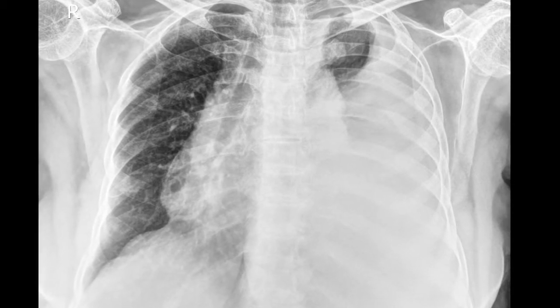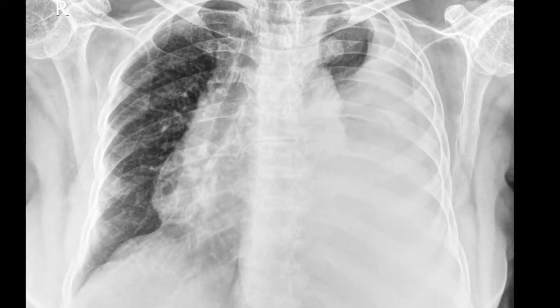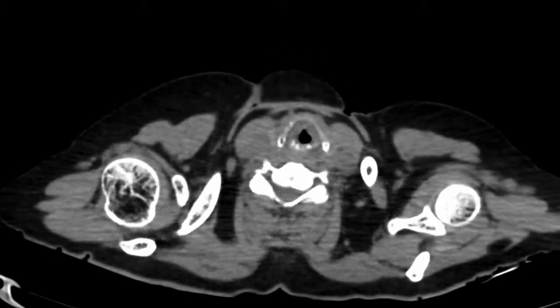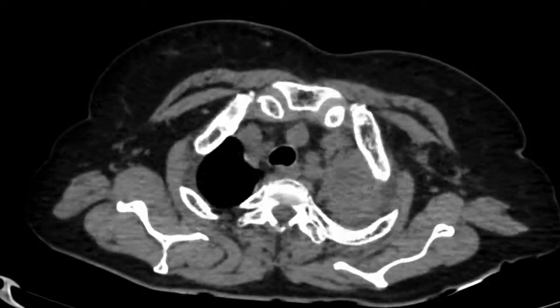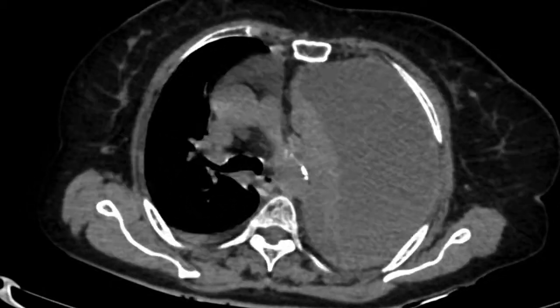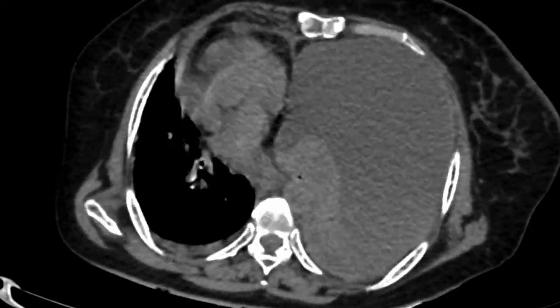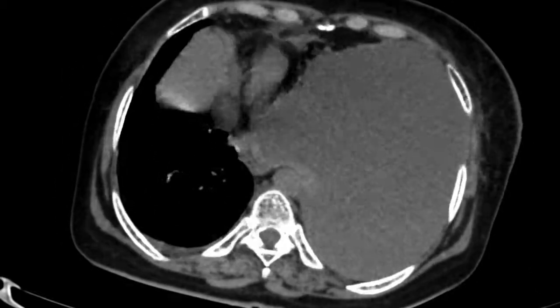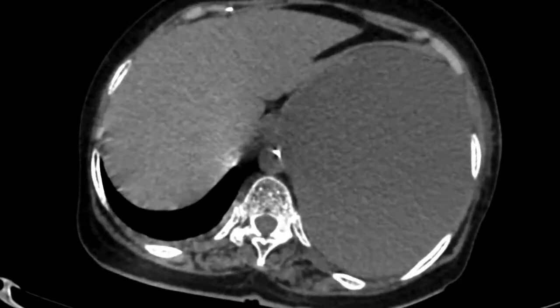We still have the cardiomediastinal shift to the opposite side, to the right side. We put the patient on a CT scan table to find out what the problem was. What we see here is a massive left-sided pleural effusion with the fluid completely occupying the left chest. There is underlying lung collapse, as we can see, and the heart has shifted to the opposite side.